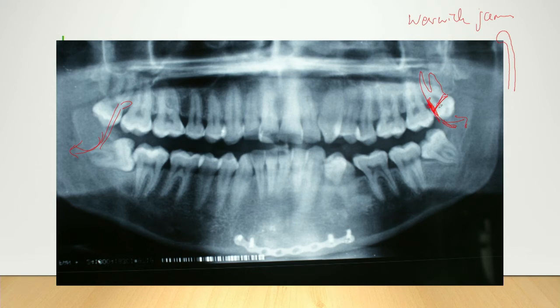So with upper wisdom teeth, because the bone is soft, it doesn't matter so much if you have almost no coronal tooth structure, as long as you can get an instrument equicrestal or just subcrestal, round about this area, so that you've got a good application point with a Warwick James to rotate the tooth out, or a luxator.